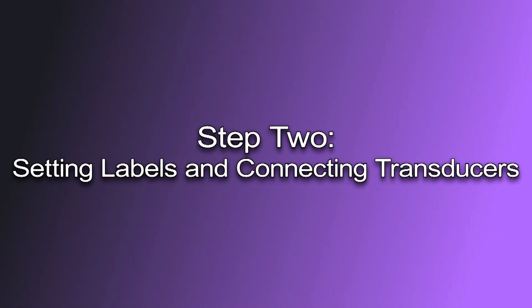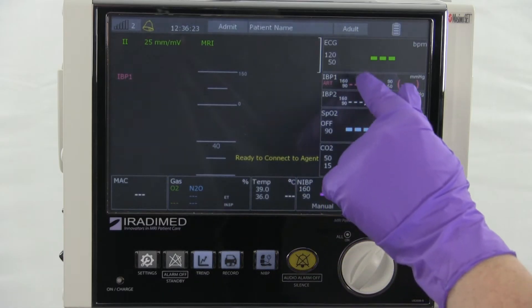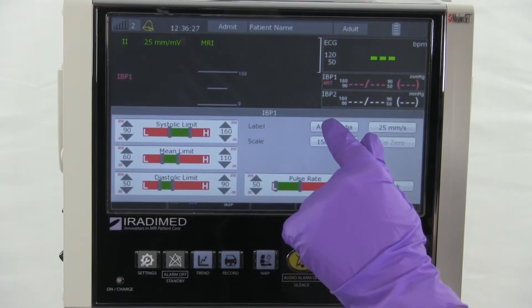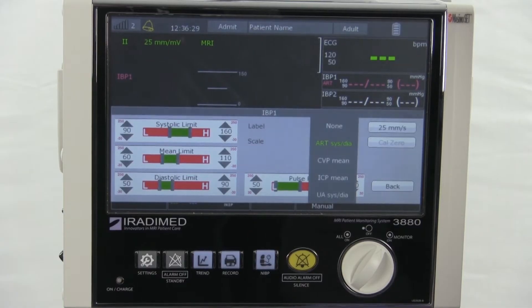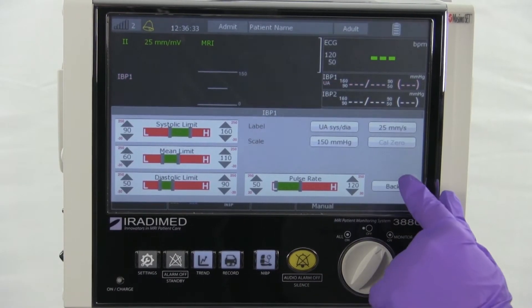Step 2: Setting Labels and Connecting Transducers. For the next step, the user will select the label of the IBP reading. The user will click the IBP box on the monitor and select the label type. The user will select the most appropriate label depending on the placement of the invasive line on the patient.